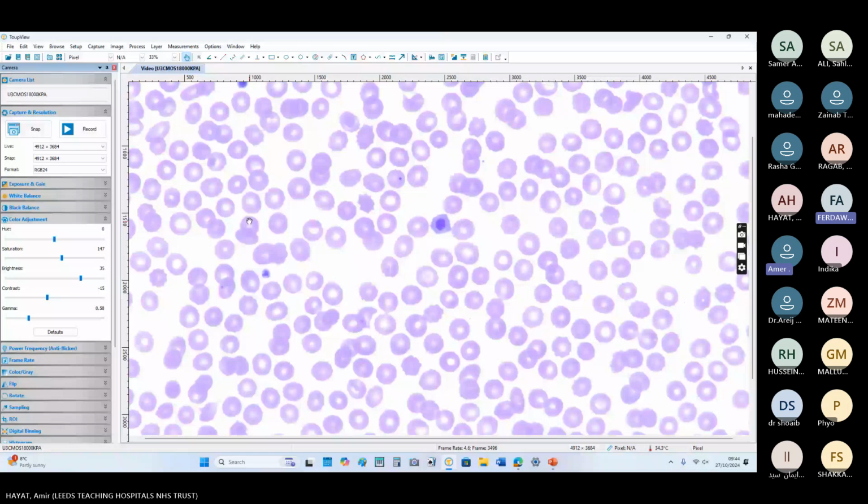Yeah. But when they ask about possible causes, shall we mention the causes in view of the background history, or just according to the blood count? Background history, which is the likely cause, should be on the top, which is the most likely cause. The least likely cause should be at the bottom of the list.